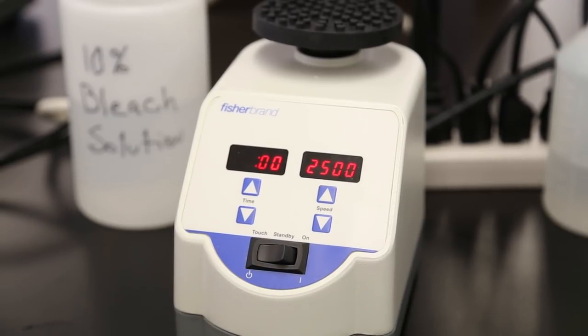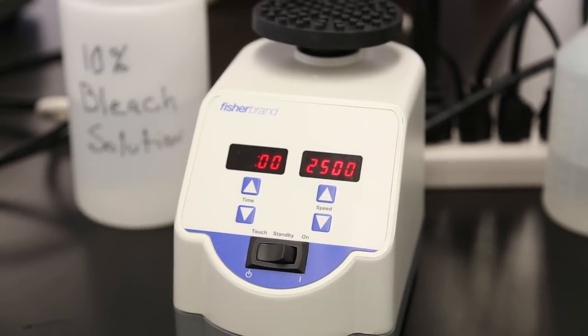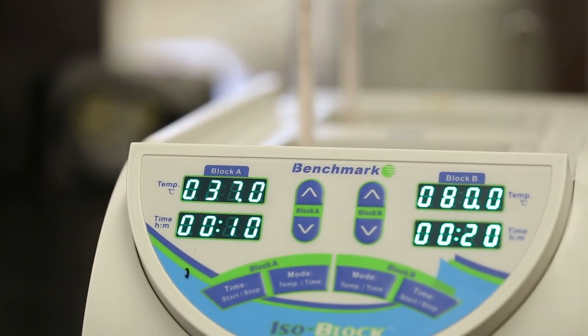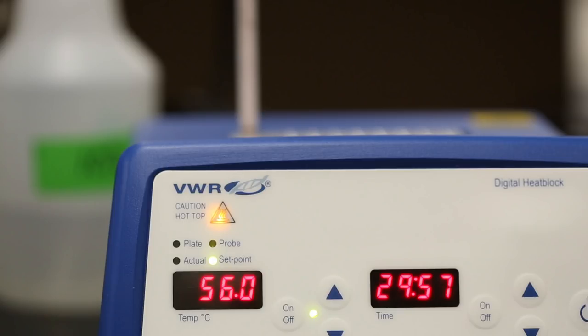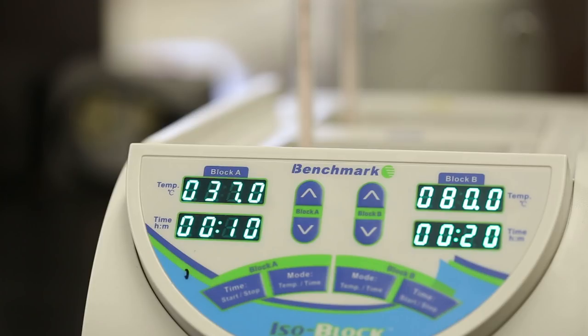Now, make sure that the vortex is plugged in and turned on. Check the three heaters. They should read 37 degrees, 80 degrees, and 56 degrees Celsius respectively. If they do not, they may still be heating.